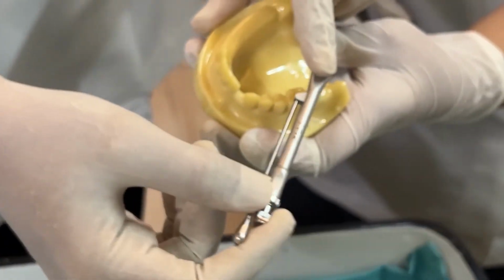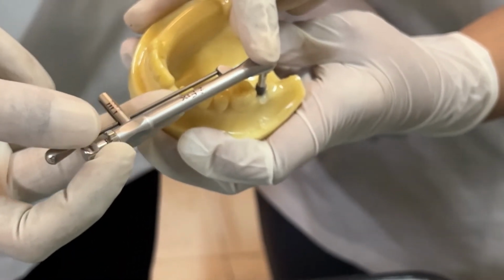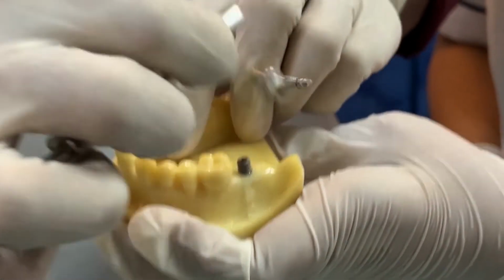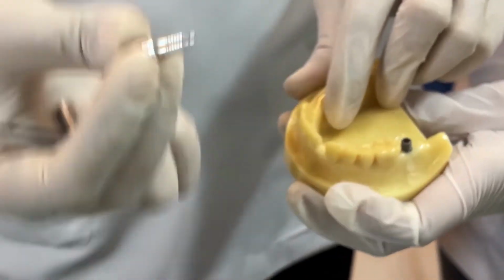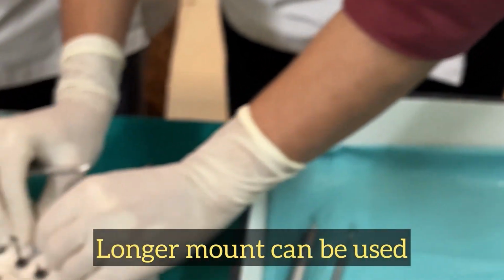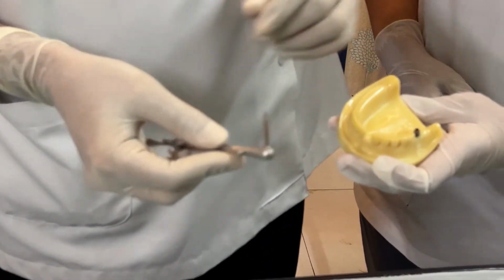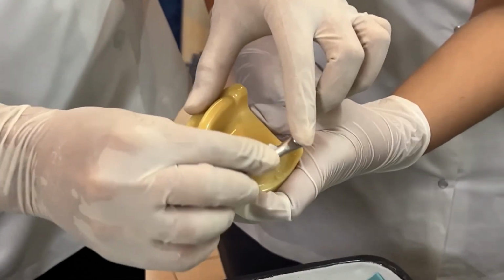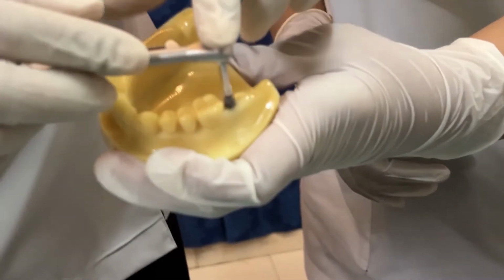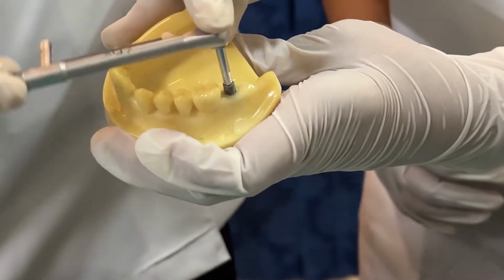Now suppose at some juncture in the patient's mouth you were rotating, but the patient's adjacent teeth or the lip start interfering. What you can do is you can always remove this extended mount and use the longer mount also which is available. So this is the longer mount which is available in all the kits, and this we can just engage it once, and we have to engage it first. Right now it is not engaged, now it is engaged, hex to hex, and now we can start rotating it.